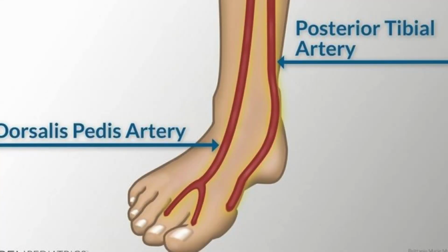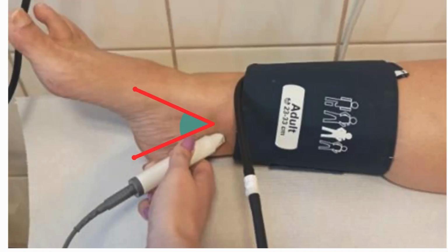Here's how to use a handheld Doppler step by step. You first apply gel to the skin over the artery, either the dorsalis pedis or posterior tibialis. Then you hold the probe at a 45 to 60 degree angle, not flat, not straight down. Move slowly until you hear a strong signal. Listen to the rhythm, then compare it bilaterally. Don't just say pulse is present. You should say triphasic flow dorsalis pedis bilaterally. That's real documentation.